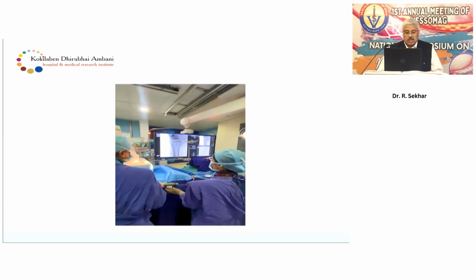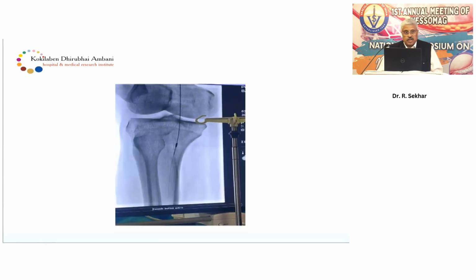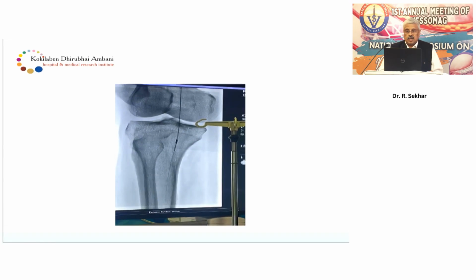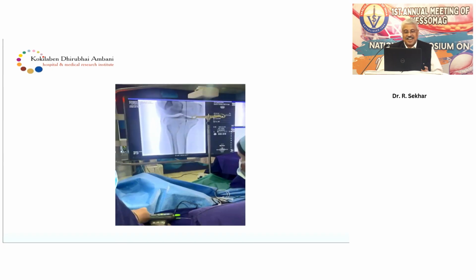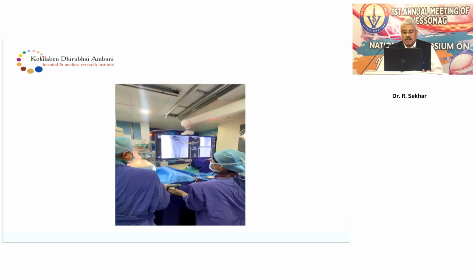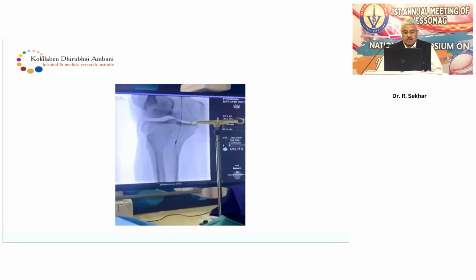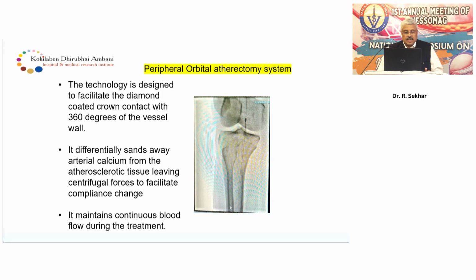Many of you might not have used it, but when you use it, it makes the sound of an aircraft landing, it's that loud. So you can actually get the feel of something being shaved inside. That's the video of that. As I said, the technology is a diamond-coated head which basically sandpapers everything off.